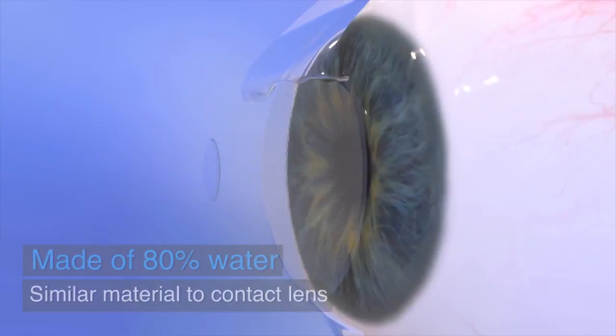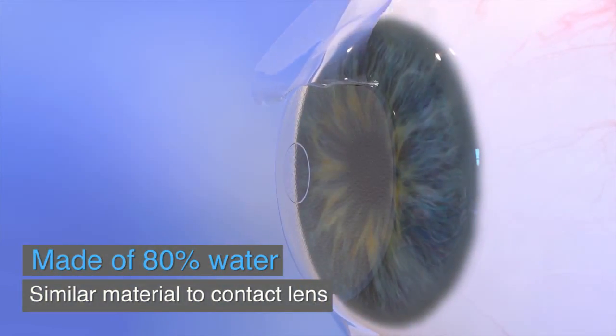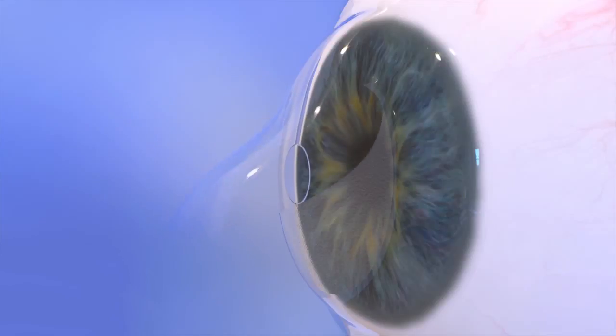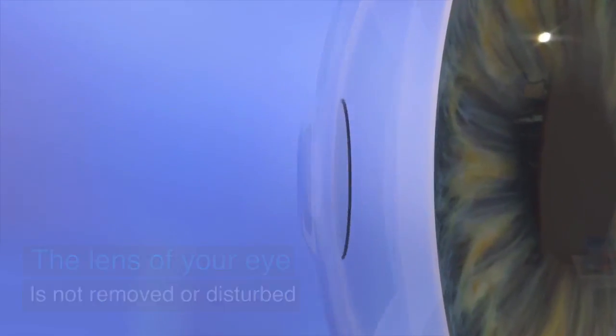Raindrop is a small transparent disc made of approximately 80% water and similar material to a soft contact lens. Unlike other procedures to fix the need for reading glasses, Raindrop does not remove or disturb the lens of your eye.